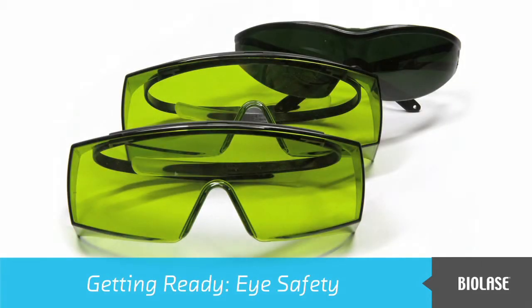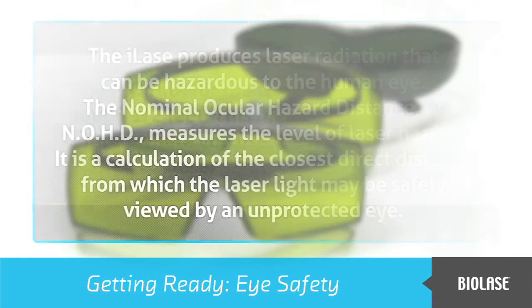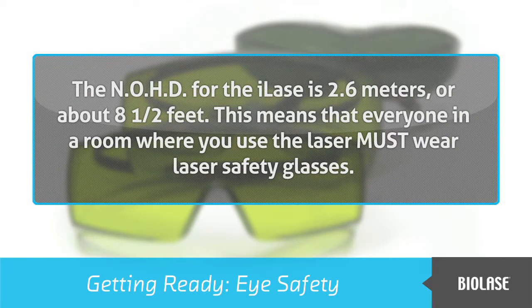Before we start the iLase, there is important information about eye safety that you need to know. The iLase produces laser radiation that can be hazardous to the human eye. The nominal ocular hazard distance, or NOHD, measures the level of laser hazard. It is a calculation of the closest direct distance from which the laser light may be safely viewed by an unprotected eye. The NOHD for the iLase is 2.6 meters, or about 8.5 feet.